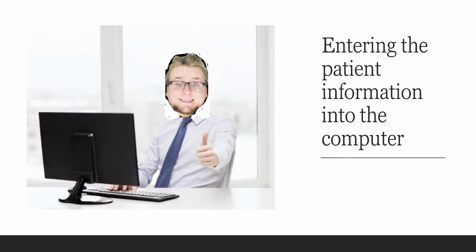After she was positioned on the table, I started to input her information into the acquisition computer, making sure her height and weight, pre-injection dose and time, injection dose and time, and post-injection dose and time were correctly inputted into the acquisition station.